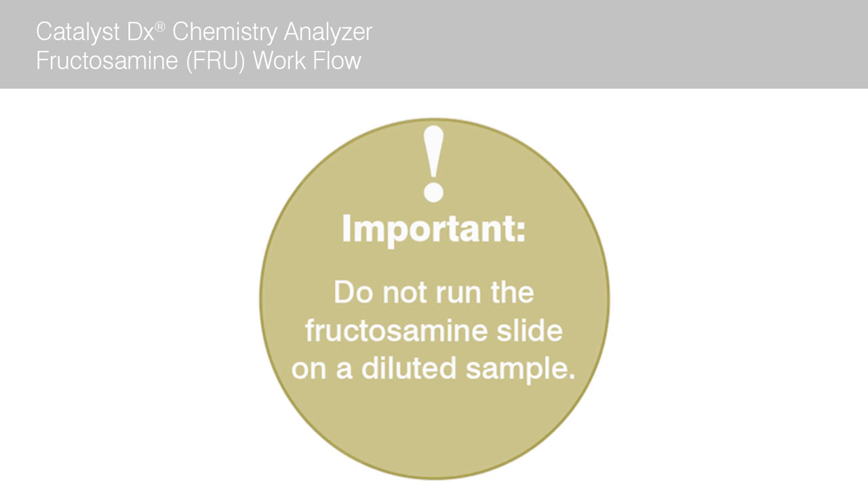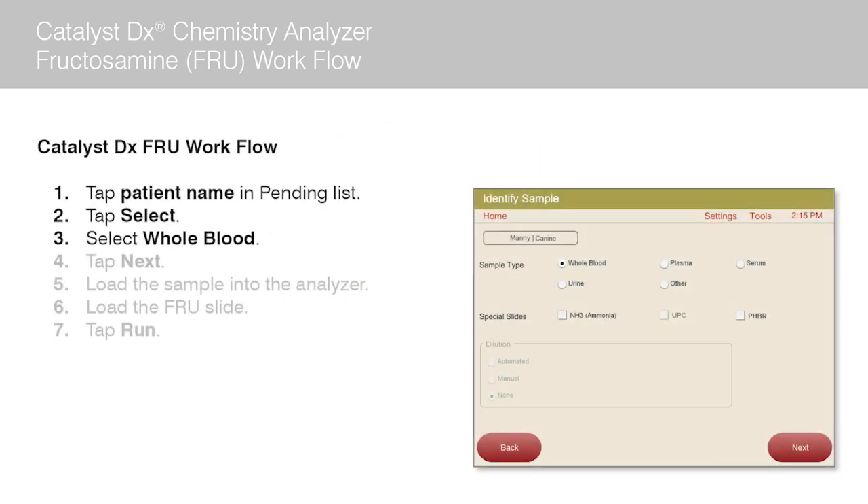Important. Unlike other chemistry slides, it is not recommended to run a fructosamine slide on a diluted sample as results can be compromised. Now tap next.